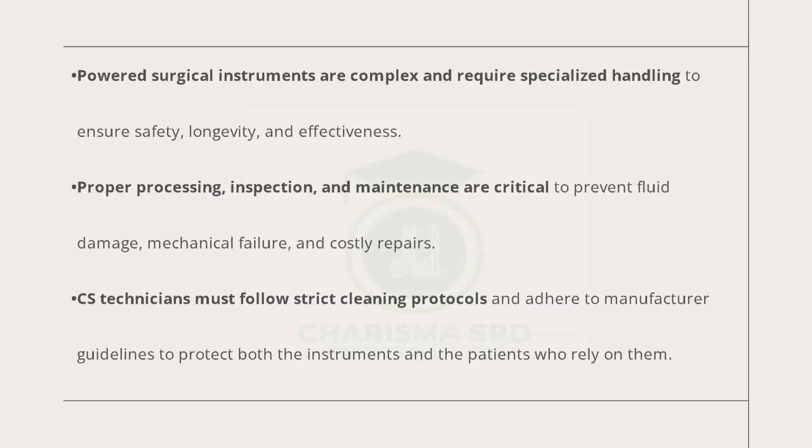Before you sterilize your battery, you have to make sure that it is charged. Then you use the charged battery to test the functionality of your handpiece. You have to check for functionality, make sure that where it needs to be lubricated is lubricated, and then you test to make sure that it is working.